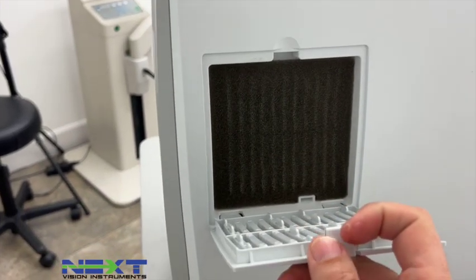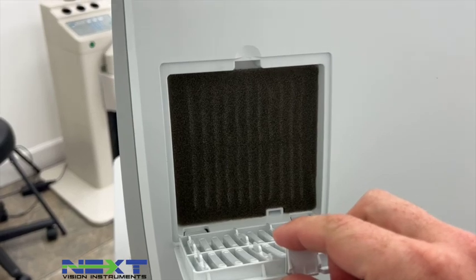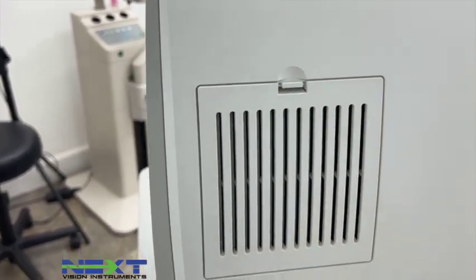We'll tuck all the cords, place the two little tabs, and push the door closed. Right above this access port there's another door — this is the filter. Definitely make sure this is blown out with canned air at least once a month, very important for the life and longevity of your machine.